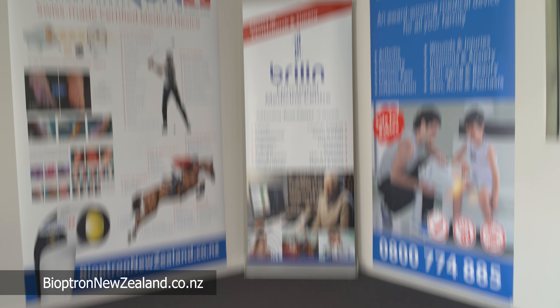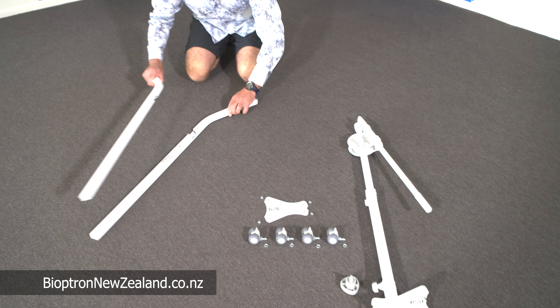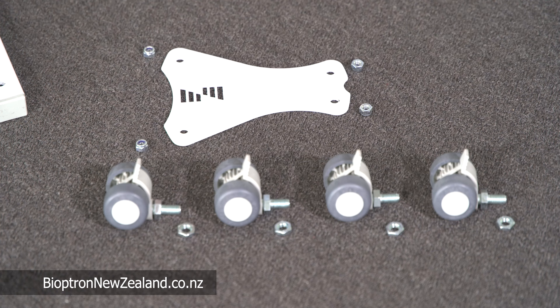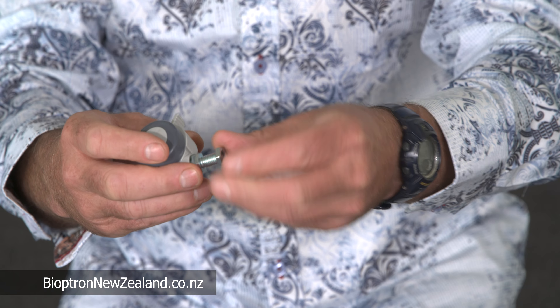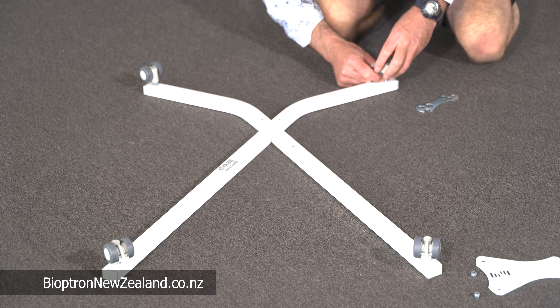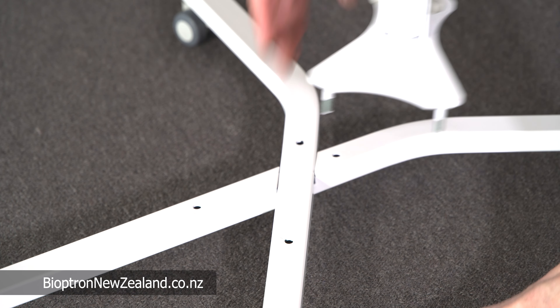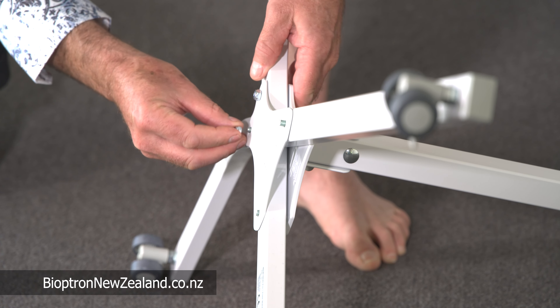Let's get started. It's best to lay all the parts out on the floor, and then put the legs together as demonstrated. Now it's time to screw the bolts on the base of the wheels, and then the four wheels are screwed on underneath the legs. Turn the legs over and attach the main shaft. The main shaft has a base plate and you simply attach the four bolts securely.